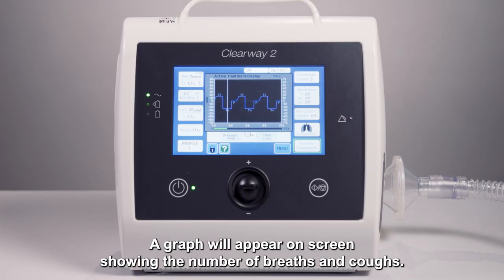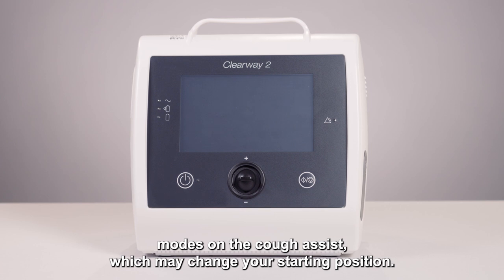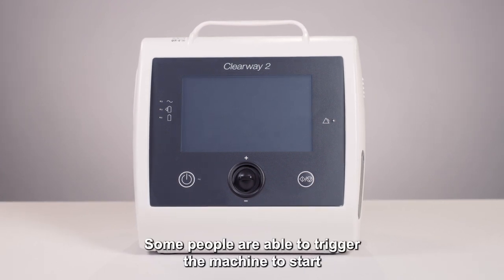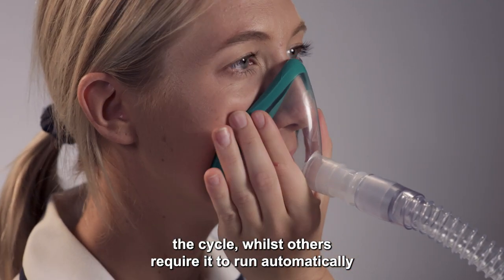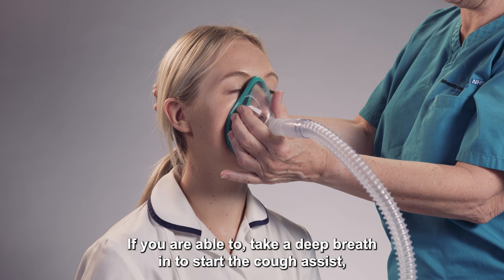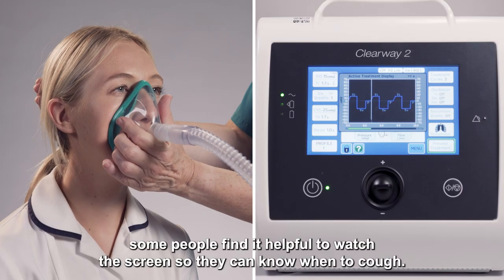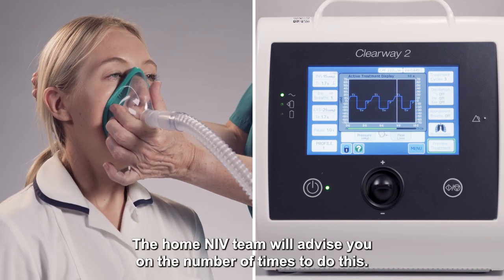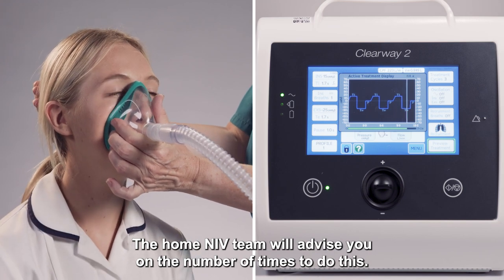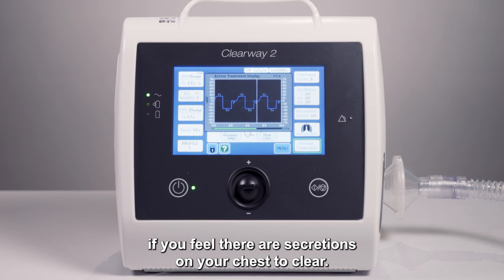A graph will appear on screen showing the number of breaths and coughs. There are different modes on the Cough Assist which may change your starting position. Some people are able to trigger the machine to start the cycle, whilst others require it to run automatically if it takes too much effort. If you are able to, take a deep breath in to start the Cough Assist. Some people find it helpful to watch the screen so they can know when to cough. The Home and IV Team will advise you on the number of times to do this. You may need to do another cycle if you feel there are secretions on your chest to clear.